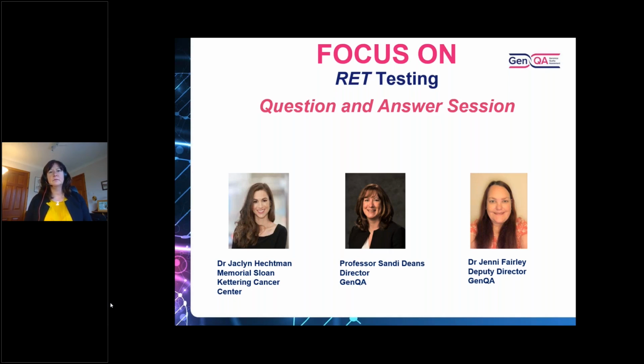The laboratories have the opportunity to appeal if they think we've made a mistake. And then if it's confirmed that the laboratory has made an error, we will run that by our specialist advisory group to confirm the error. Then we follow this up with a root cause analysis. So we ask the laboratories to investigate their root cause analysis. And if they need any assistance with that, we're quite happy to provide any laboratories with assistance to investigate any problems they have in their testing.